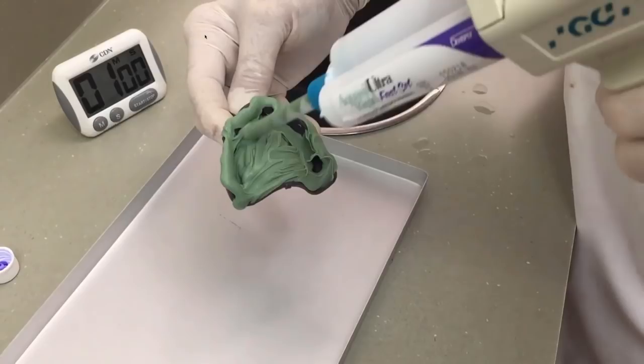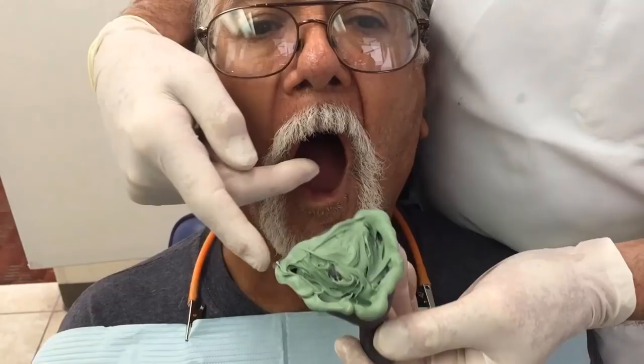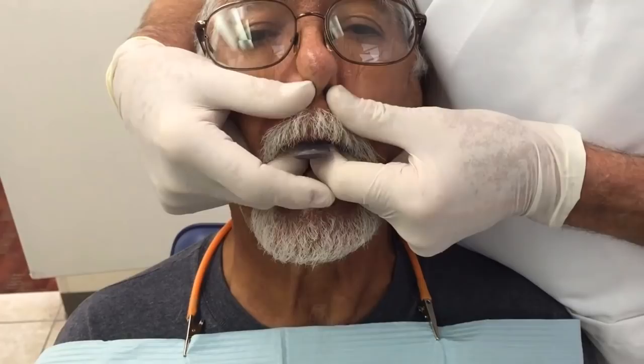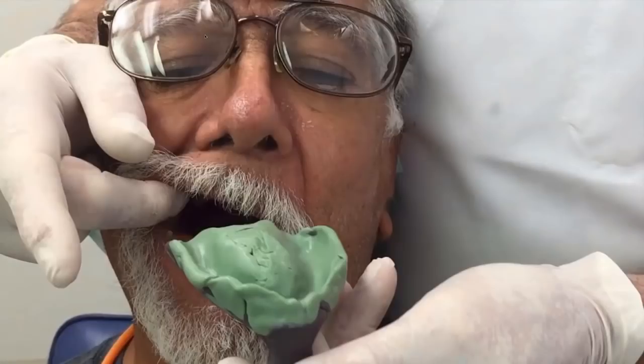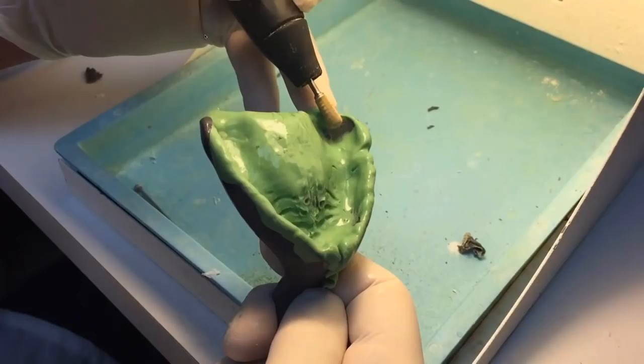Take that to the mouth and have the patient go through border molding motions. Leave it in for two and a half minutes, molding the material for the first 30 seconds. Remove it and examine the tray, looking for areas where the tray has perforated the material you placed. Any place where the tray shows through, you'll presume the tray is pushing on the tissues and you need to relieve it — simply use a carbide burr and grind out whatever areas present as show-throughs.